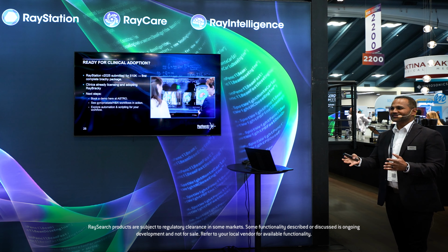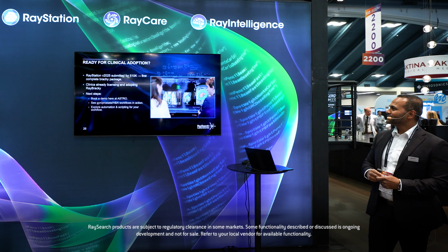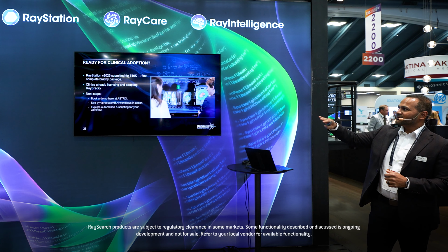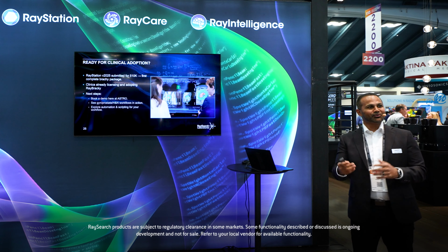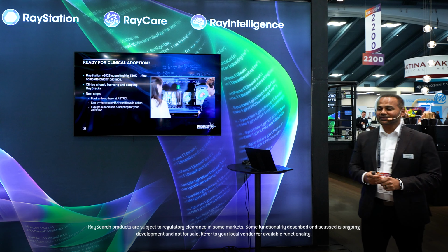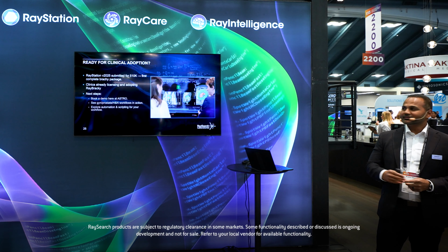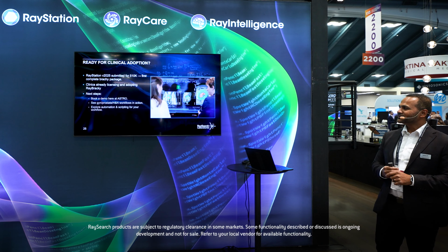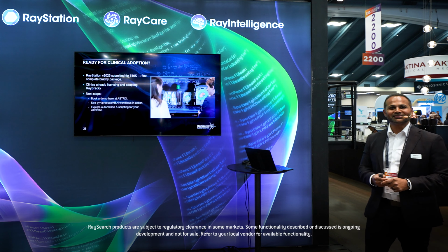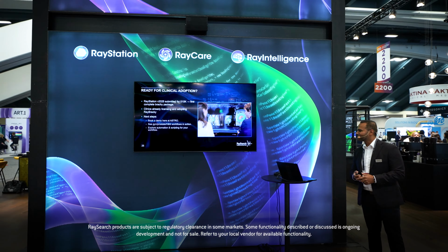So what do we do next? We've been talking about it. Version 2025 was submitted to the FDA for 510(k) clearance. We believe that's our first complete brachy package that you should have no limitation in switching over to, because we've given you all the tools to make RayStation work. So clinics already have started licensing it and adopting RayBrachy. So I would say the next step is come on by and get a demo here at ASTRO and see some of the workflows and explore some of the automation and scripting. Thank you.